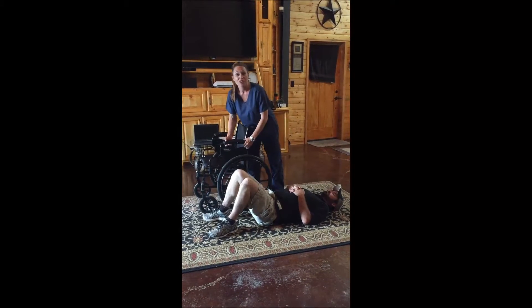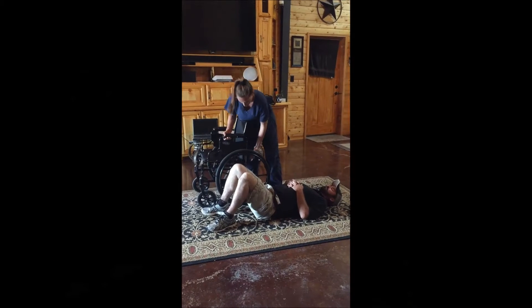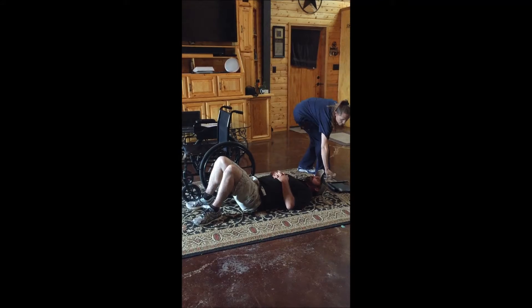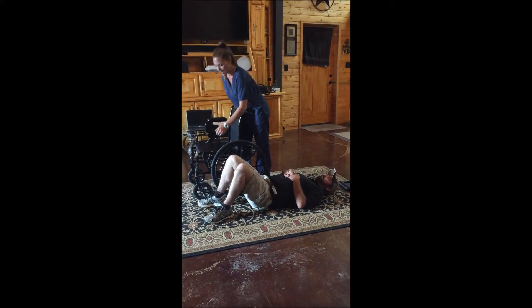First, you need to remove the armrest. Then, make sure you lock the wheelchair brake.